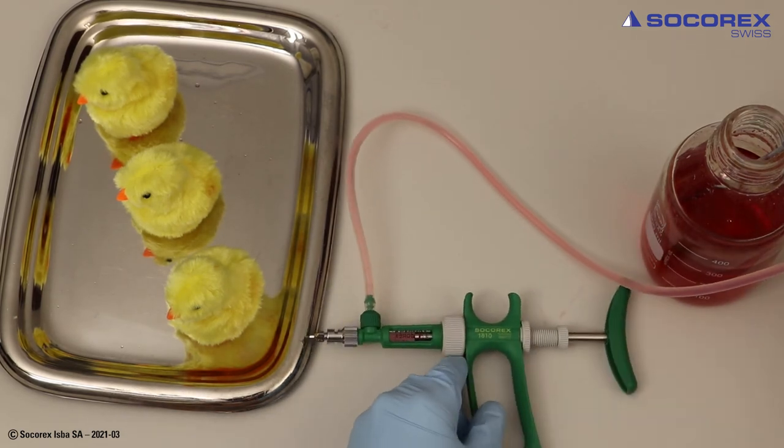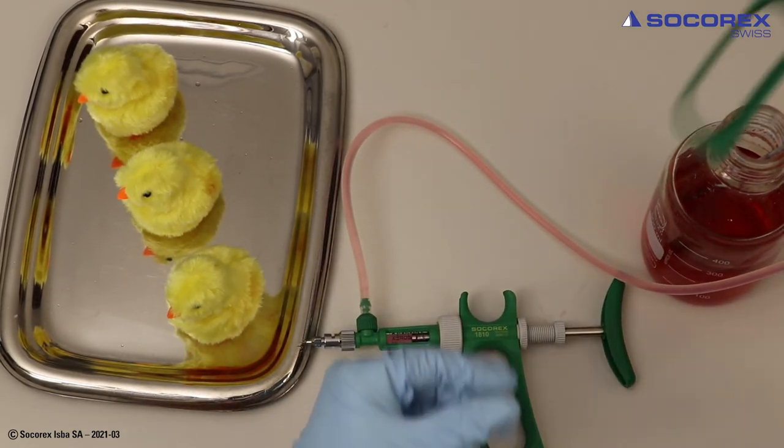If needed, for large injection series, the Abacus shunt counter provides for easy counting of injected doses.